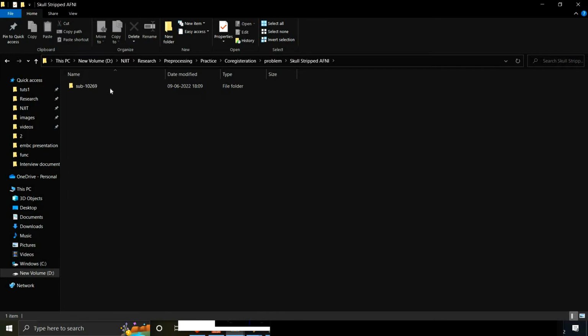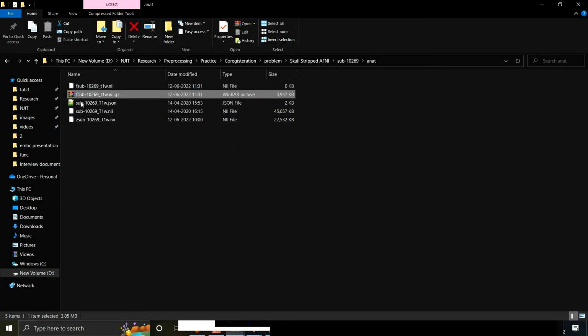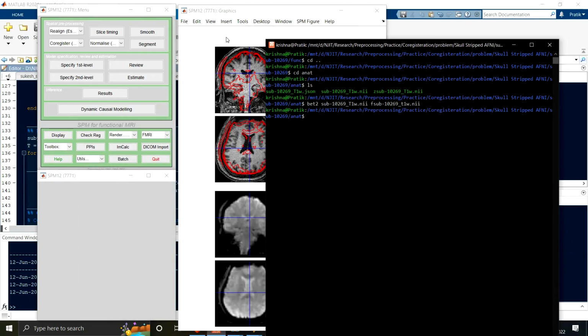here it is. If you see, it makes a .gz file. It is a zip file, so you can just extract the contents of this over here. So here you have the NII image. This is using FSL. You can do the same using AFNI as well.